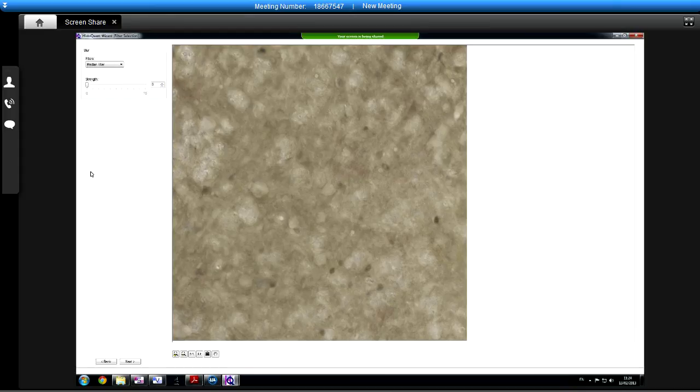It has the effect of making the image look a bit blurred and out of focus, but from an analysis point of view, it actually makes it a bit easier for the software. There's two options here, and to be honest with you, it's a little bit of a case of trial and error as to which one works. The first one, the median filter, as you slide it up here, you see the effect it has. It's quite a subtle softening of the image. So I'd say this one doesn't need an awful lot doing to it.